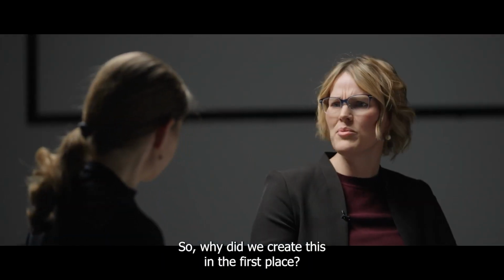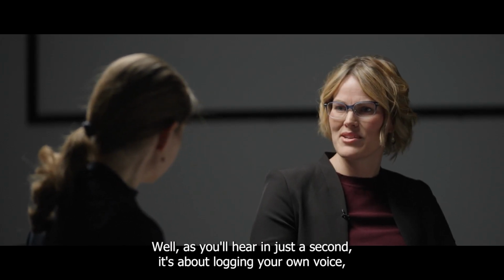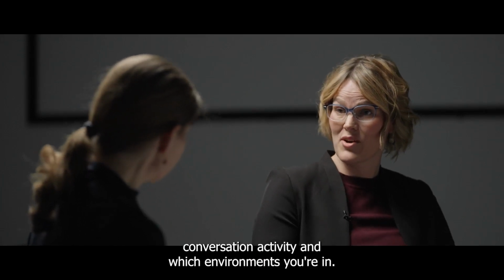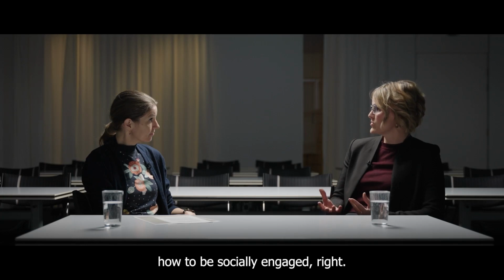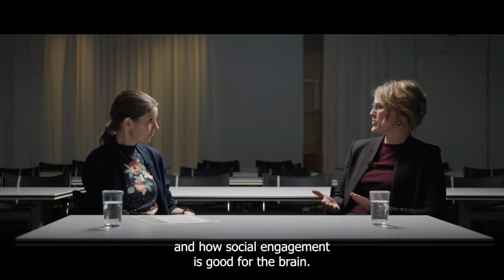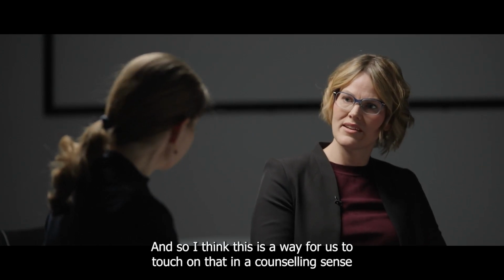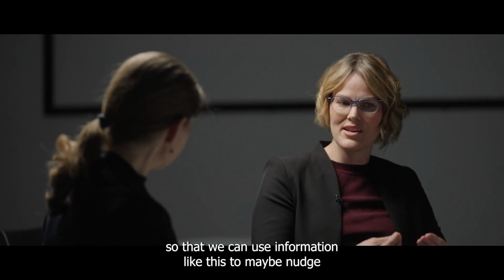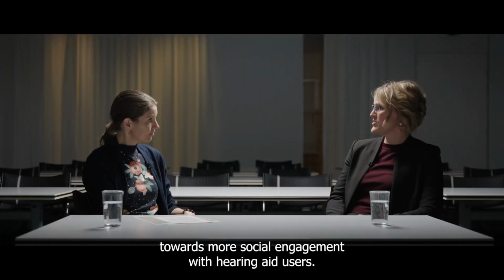So why did we create this in the first place? Well, as you'll hear in just a second, it's about logging your own voice, conversation activity, and which environments you're in. And this information is so important when we talk about how to be socially engaged, right? So we always like to talk about how hearing health is brain health and how social engagement is good for the brain. And so I think this is a way for us to touch on that in a counseling sense so that we can use information like this to maybe nudge towards more social engagement with hearing aid users.